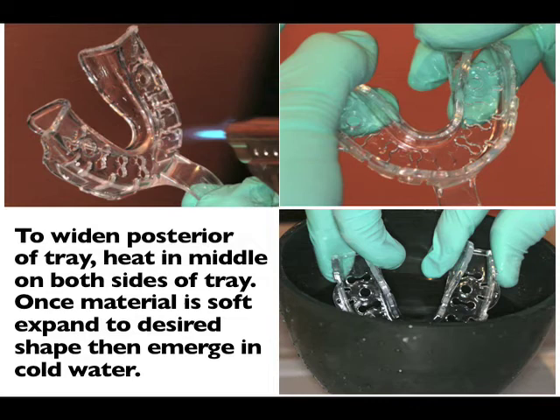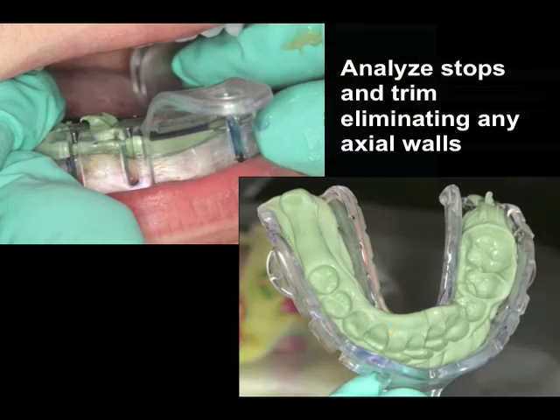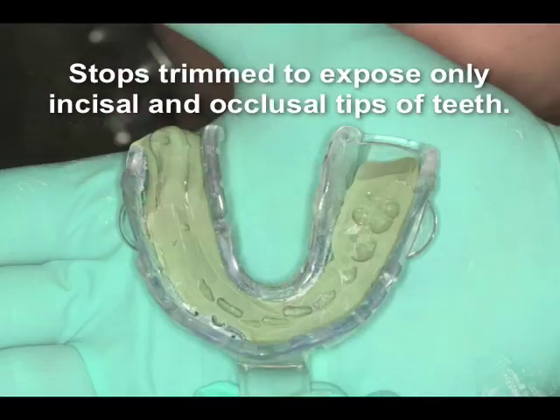Now we're going to put adhesive into the tooth channel, let that dry, and then put a ribbon of the rigid polyvinyl siloxane — this will become our stop. We now very carefully place it in, and once that sets up, we take it out and analyze the tooth indentations. The tooth indentations have very large axial walls; this is very normal. Take a bar parker or a burr and trim this down to where you only have stops — just the very incisal edges and occlusal tips of the teeth. This makes a very nice tray that will help guide you back into the same position.